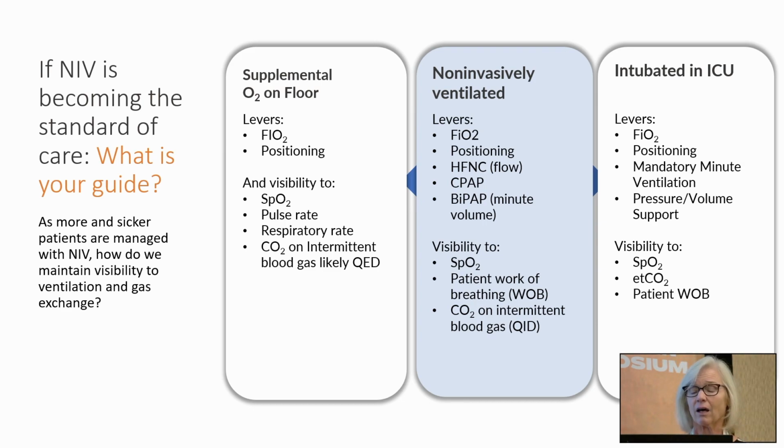The other reason why we want to avoid intubation is because what's our goal with intubation? It's extubation. Of course, you want to oxygenate and ventilate them properly, but our goal is always extubation, and you want to try to extubate them as fast as possible. We know that patients who are intubated have a longer length of stay, they have a higher cost of stay, and I've got some statistics on that a little bit later. So we're all trying to not intubate the patients. We don't want anybody intubated. We especially don't want any kids intubated.